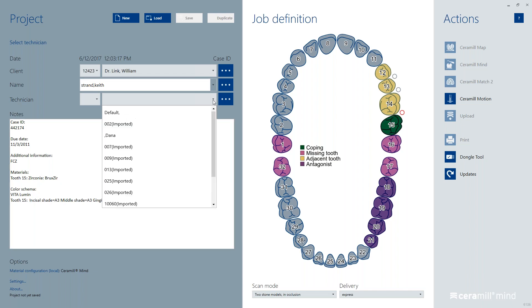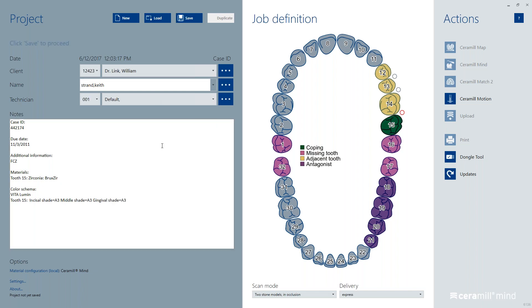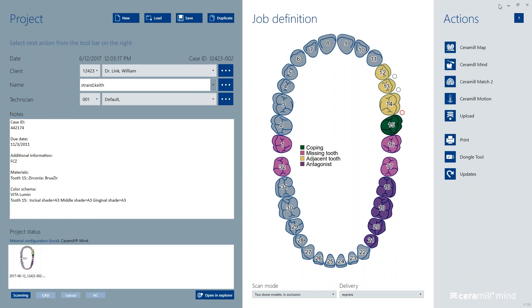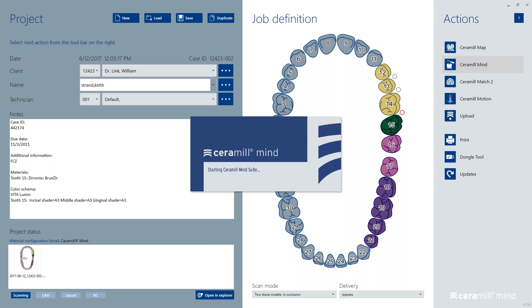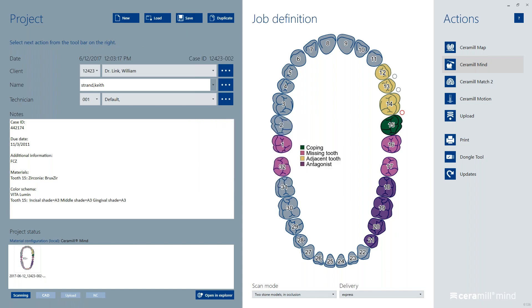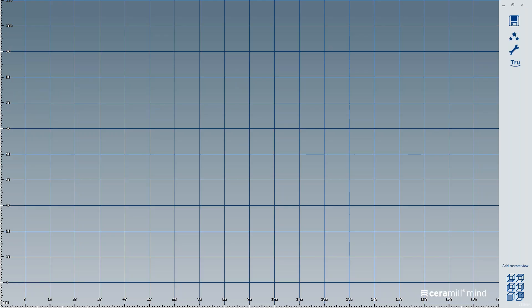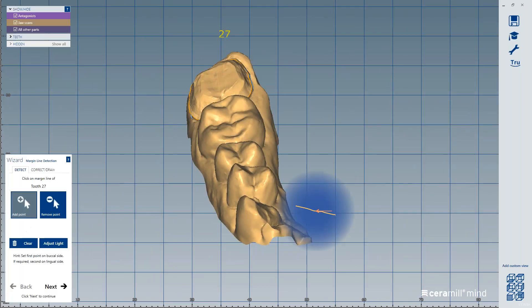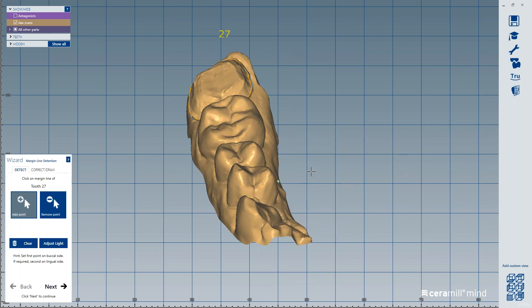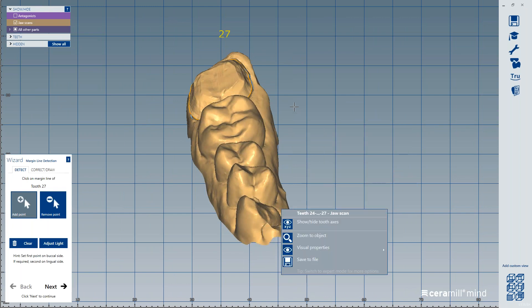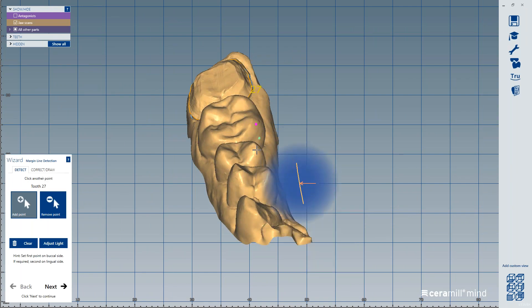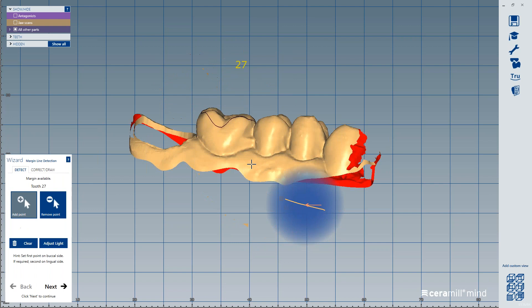At this point I would just drop down and select the technician, save the job, and slide over into our Mind software. You'll notice the information is transferred over. One thing that's really nice about that file — if you look at the file, you'll notice the margin is marked.